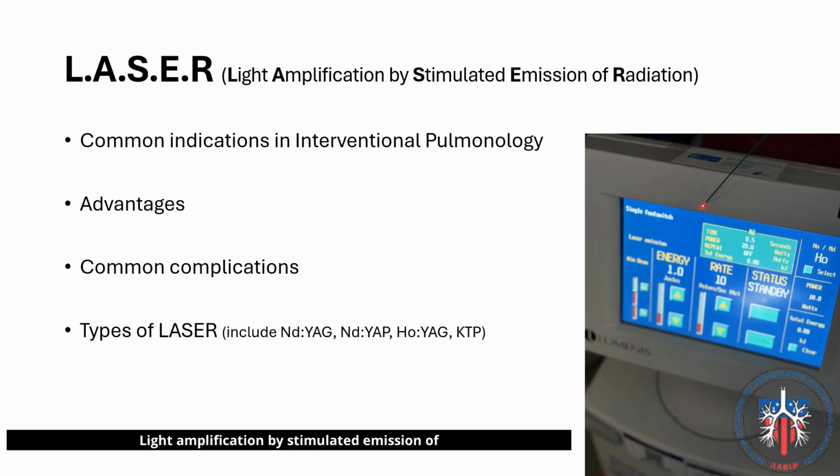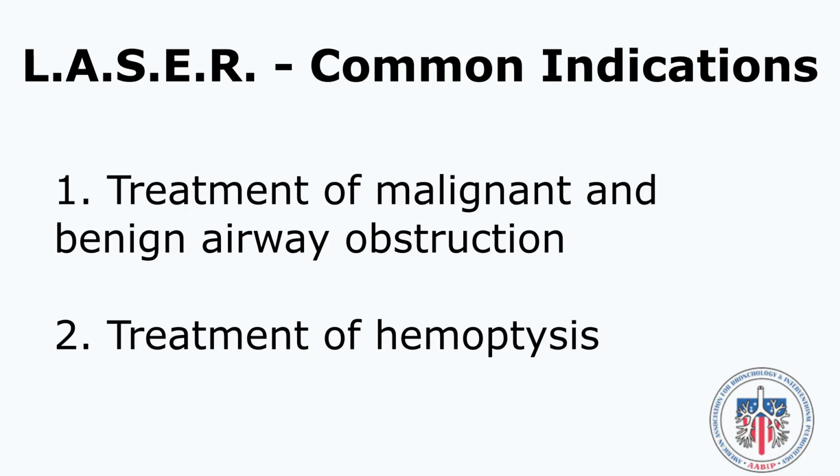Light amplification by stimulated emission of radiation, also known as laser, is a commonly used thermal ablative modality in the practice of interventional pulmonology. Common indications for endobronchial laser therapy include re-establishing airway patency in patients with malignant and non-malignant airway obstruction and the treatment of hemoptysis.